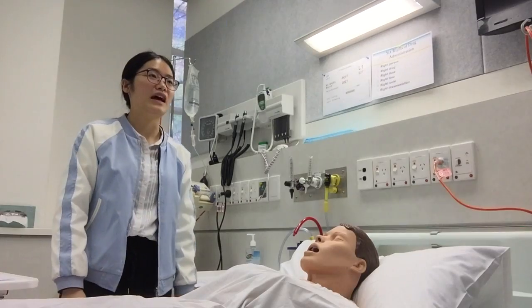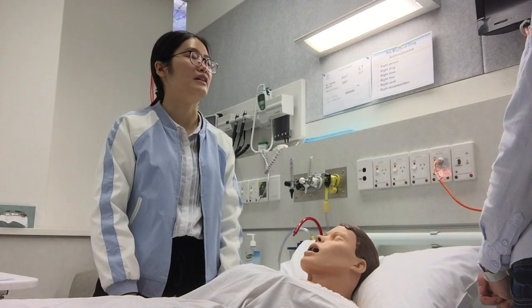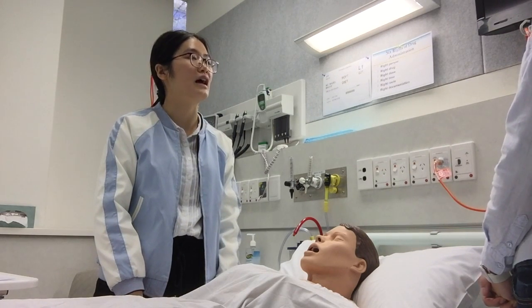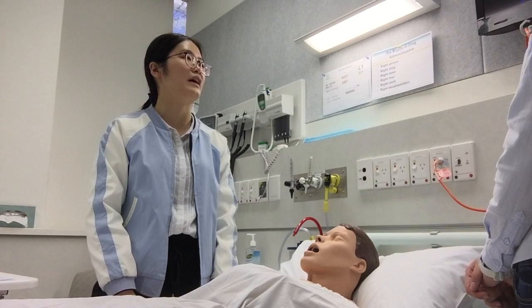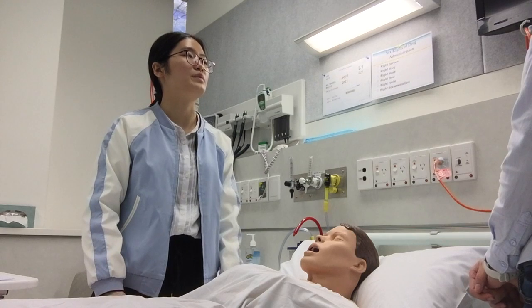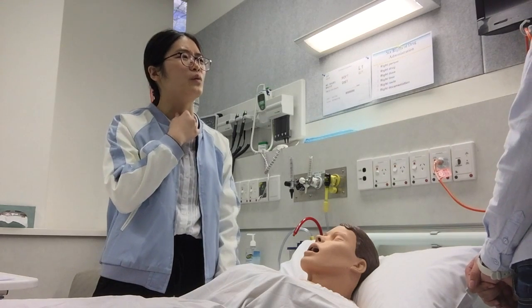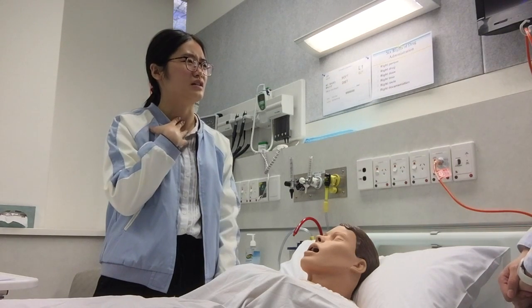Yeah. And another thing I want to add is the humidification and the nebulization. During oxygen delivery, humidifiers and nebulizers may be required. A humidifier is usually required if the patient has a potentially very dry mucous membrane, or has a tracheostomy, or has really thick airway secretions, which make them very uncomfortable and reduce the oxygen concentration.